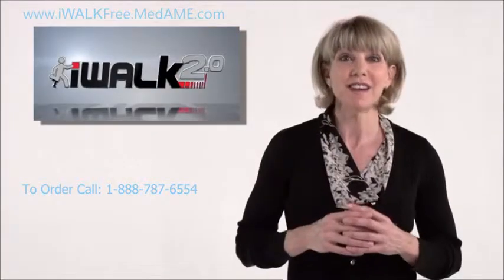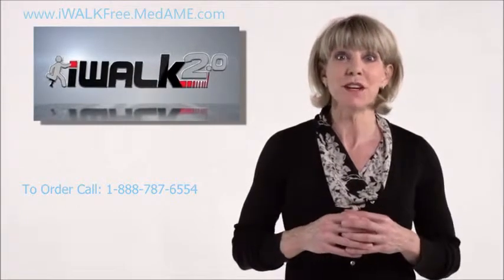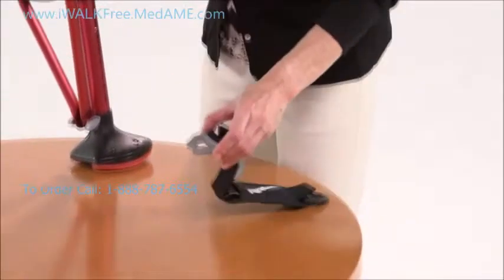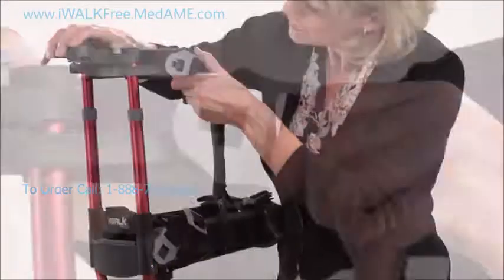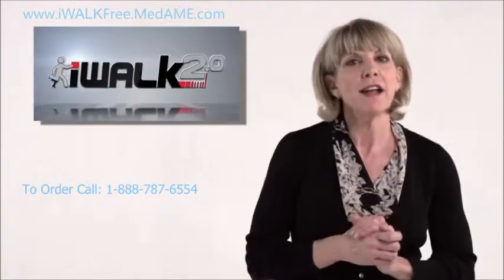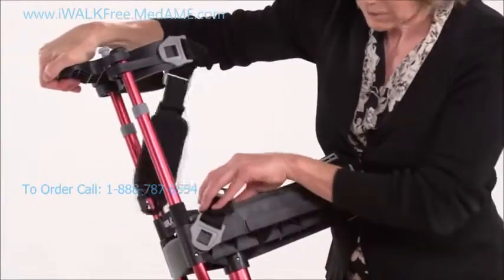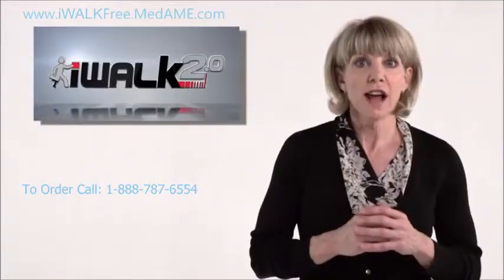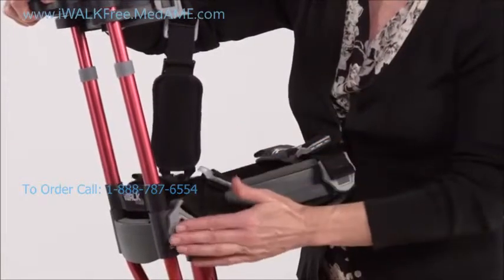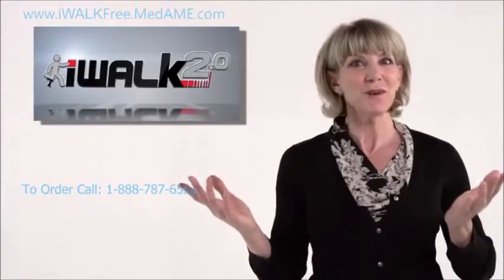The last step is installing the straps. The first two are already installed on the knee platform, and the last one goes on the thigh supports. All you do is line up the T-lock buckle of the strap with the T-post on the crutch, slip it on, pull it back, and you're done. The black buckle belongs on the inside of your leg; the gray one goes to the outside. If your crutch has a strap with a white Velcro strip on the end, make sure that is the one installed on the front of the knee platform.